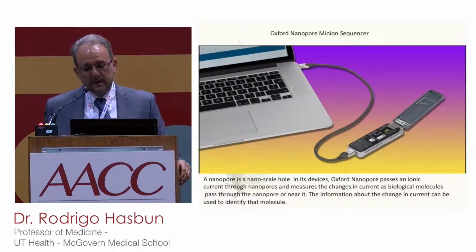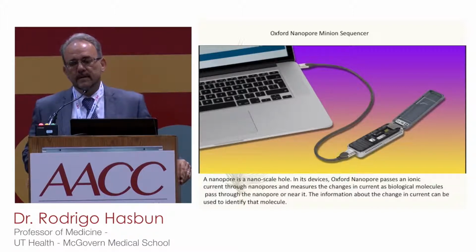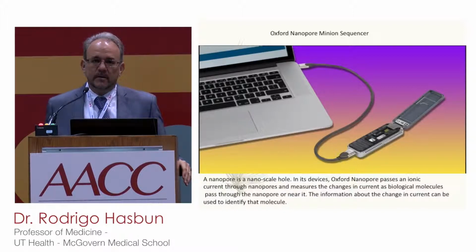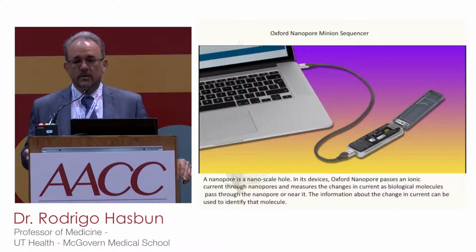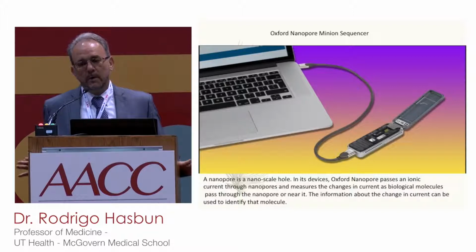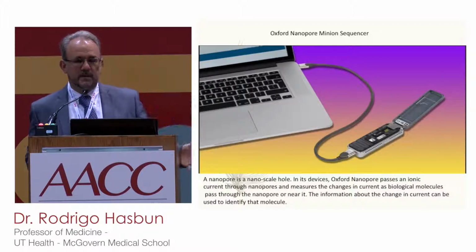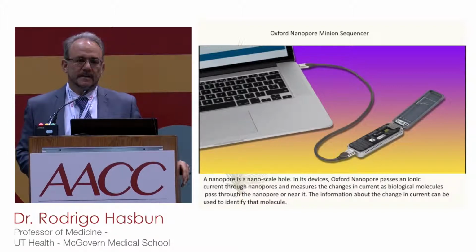We're very excited. The problem that we've seen so far with this technology is that it picks up contaminants. So you can come up and say, well, you have this bacteria, but it doesn't make any sense clinically. It's probably just a contaminant. It's so sensitive, it'll pick up anything. So that's one of the things. So if it picks up leptospirosis and you give doxy, the patient got better, great. But if it picks up something from the lab, there's nothing to do.